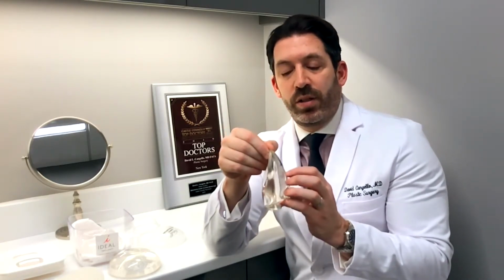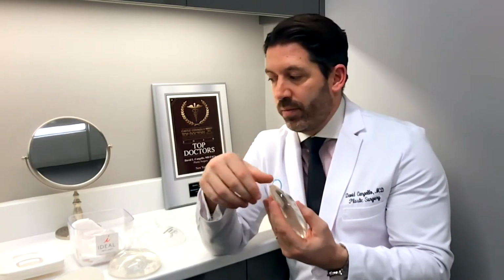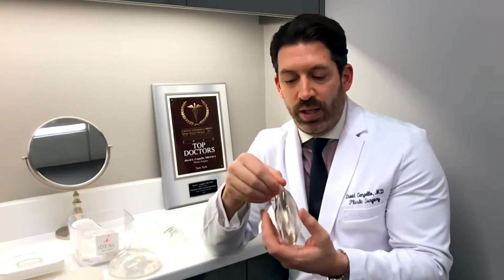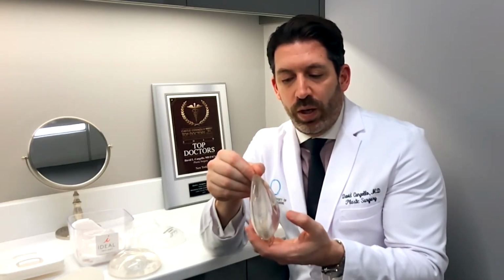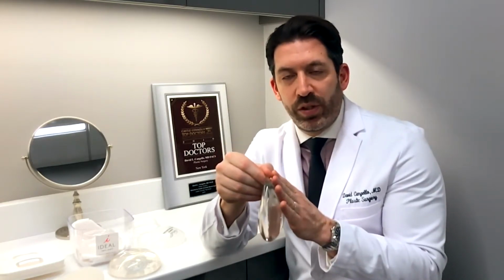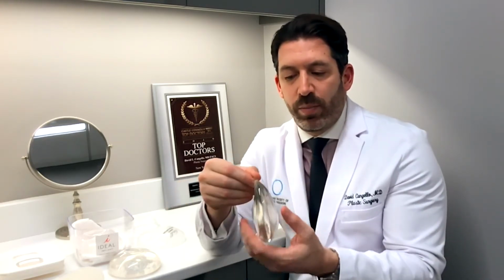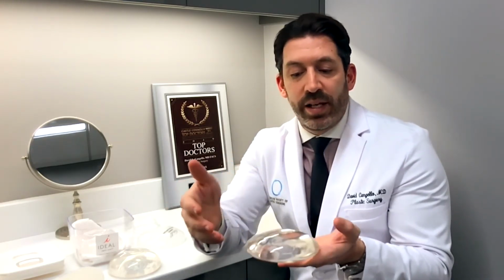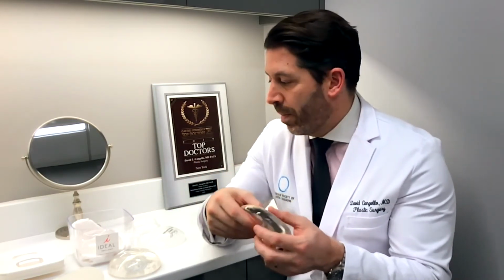Again, if you look back at this implant, when this one is held upright in a patient, the gel is less cohesive. And I'm sorry, that's one more term for the other type of implant, which is cohesive implants. But the gel here is less cohesive, so it can migrate to the bottom so that you get the fullness in the lower pole and the upper pole is thinner. So this looks just as natural as the anatomically shaped implants, yet it's softer, and if it rotates, you don't have a problem. So hopefully I've helped you understand the different types of implants, how I choose what I do.